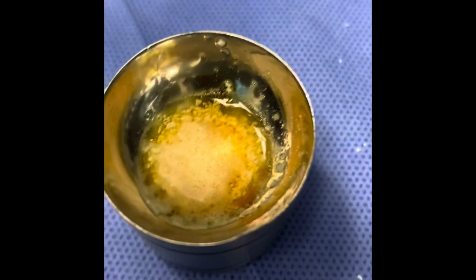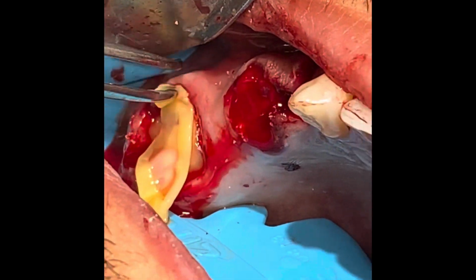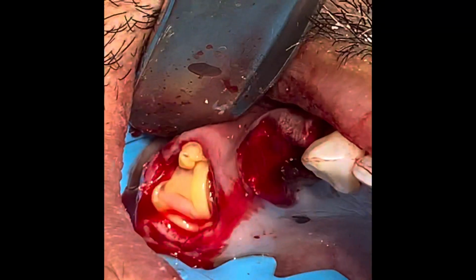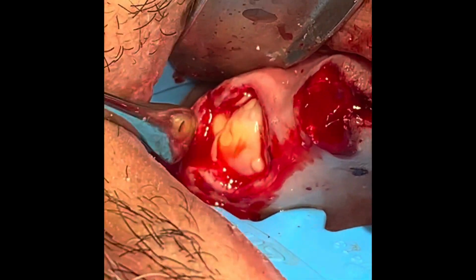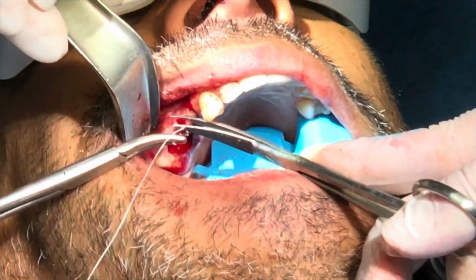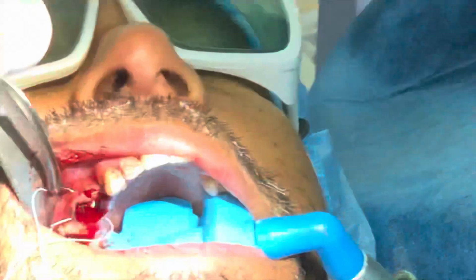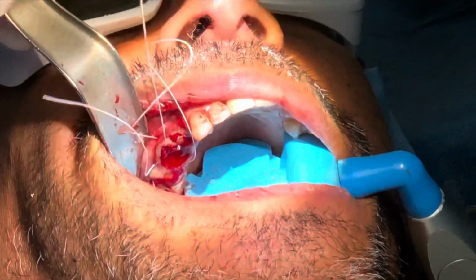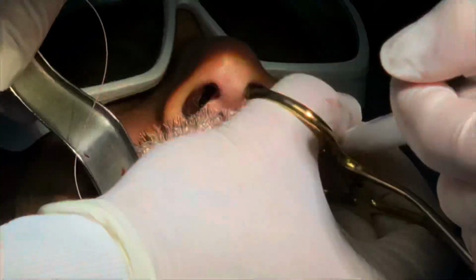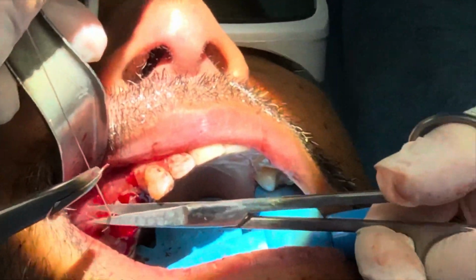Some of the liquid that's expressed from the pressing of these plugs I use to mix with the Cerasorb, which makes something called sticky bone. I loosely pack it into the depth of the socket. I cover that layer with a plug of PRF, and I cover the whole thing with a membrane of PRF, which I tuck under the flaps. I use PTFE 3-0 sutures, and I close the surgical site with mattress sutures.